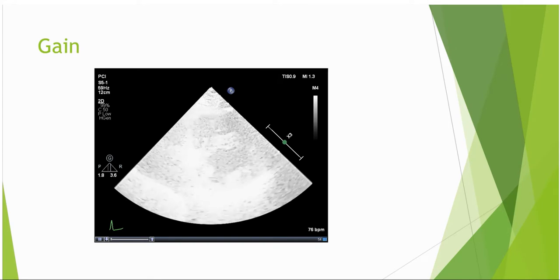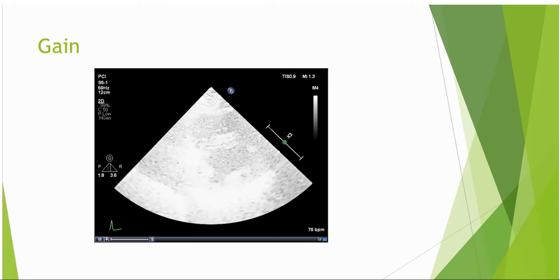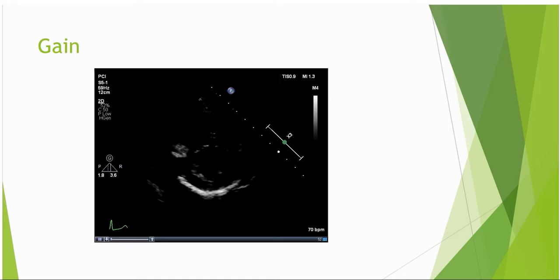Spatial resolution will drop when moving away from the optimal setting. Spatial resolution allows us to determine that two reflections are indeed from two separate structures. That is, both axial and lateral resolution are affected. As such, cranking up the gain is akin to increasing the spatial pulse length and beam width. Having the gain too high may mean the two structures blend together and can't be distinguished. Gain too low may mean we lose detail of the structure and assume them to be smaller than what their actual size is, if they can be seen at all.